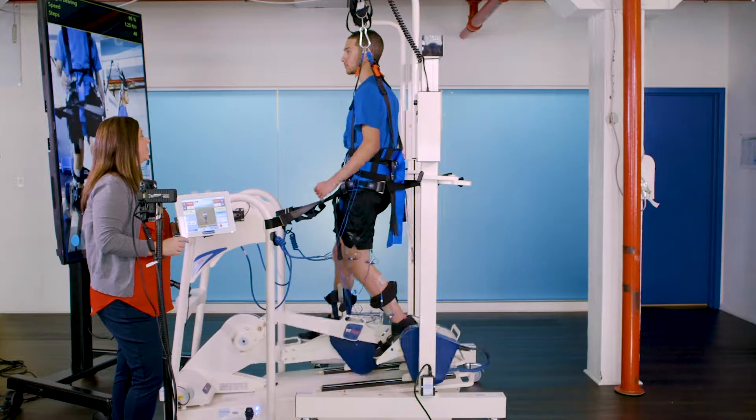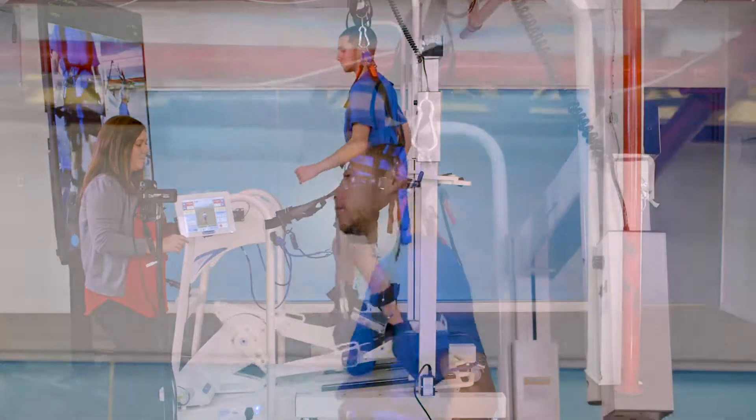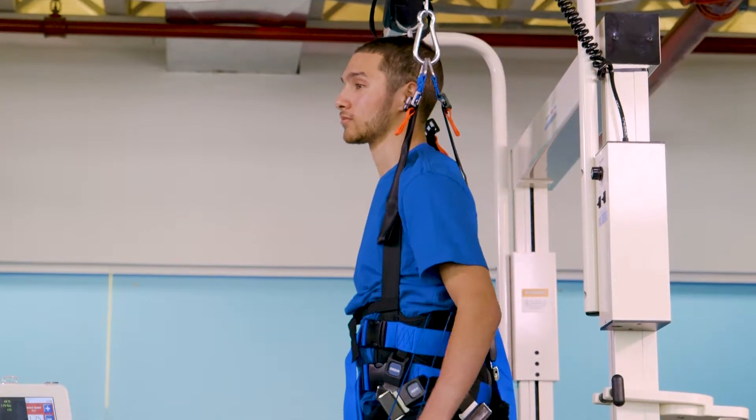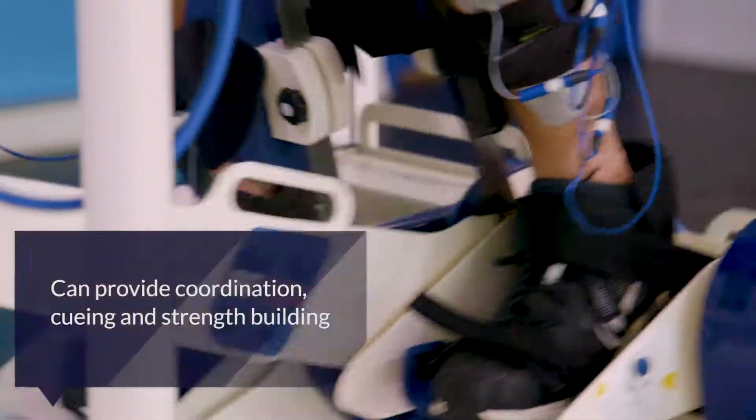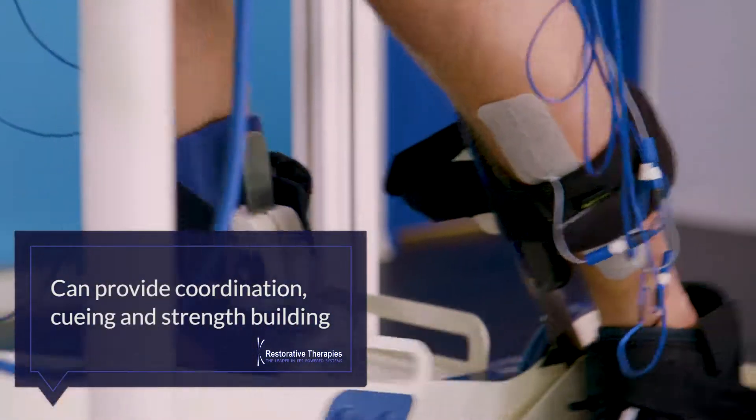With the RT600, your patient receives mass practice stepping with FES-evoked contractions, providing motor and sensory inputs which can provide coordination, cueing, and strength building.